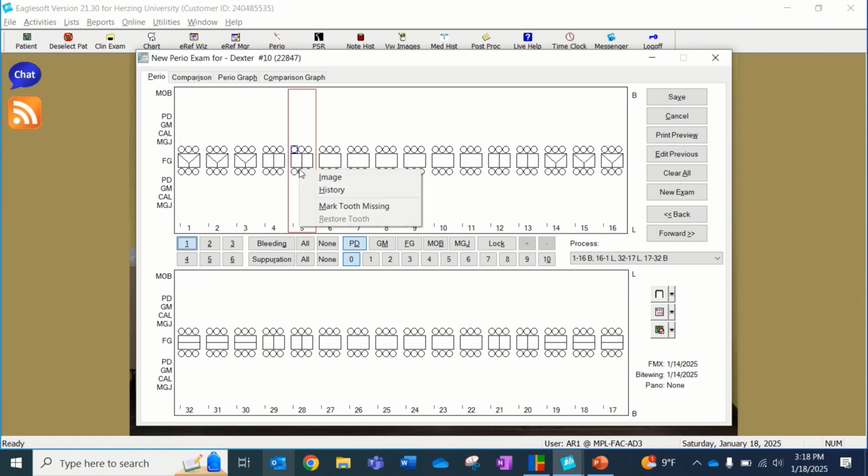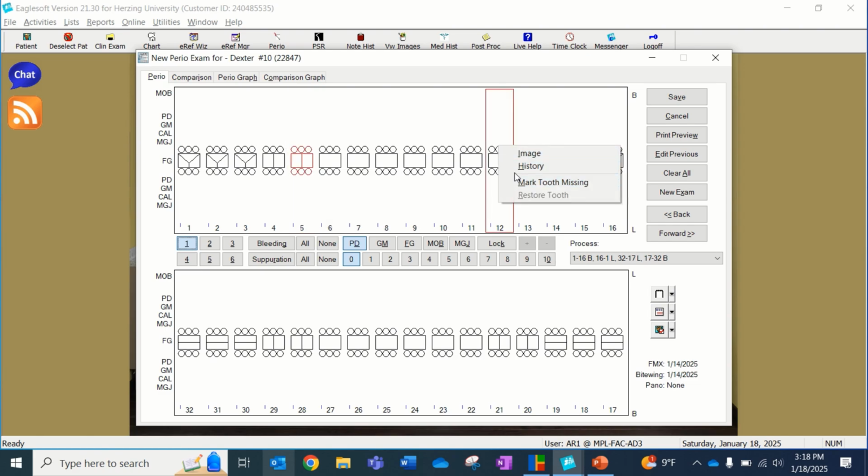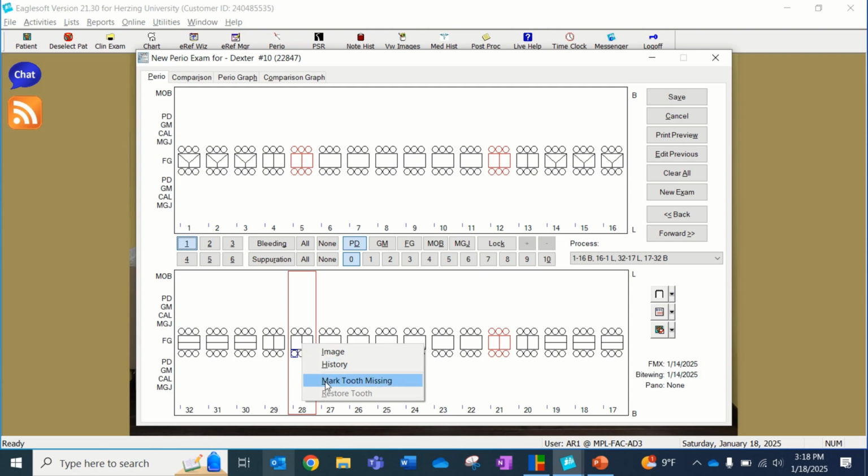So I'm just going to say number 5 is missing and number 12 is missing. I'm going to say number 21 is missing and number 28 is missing.